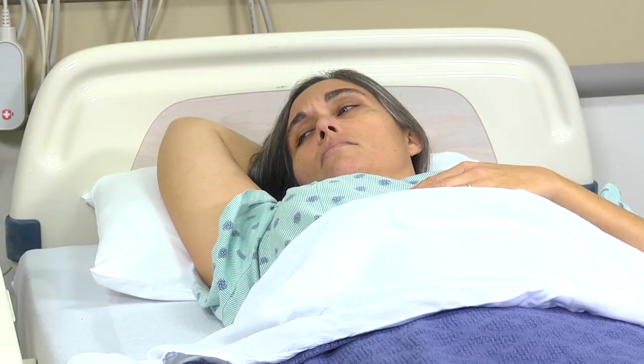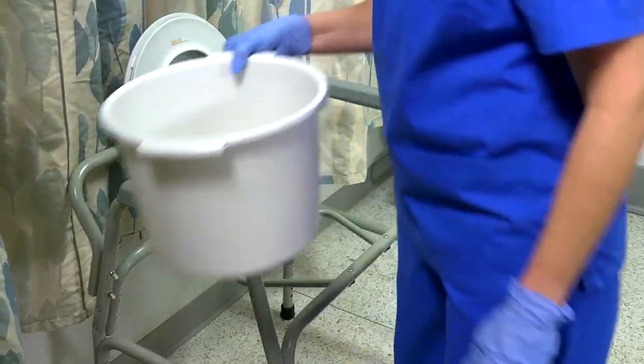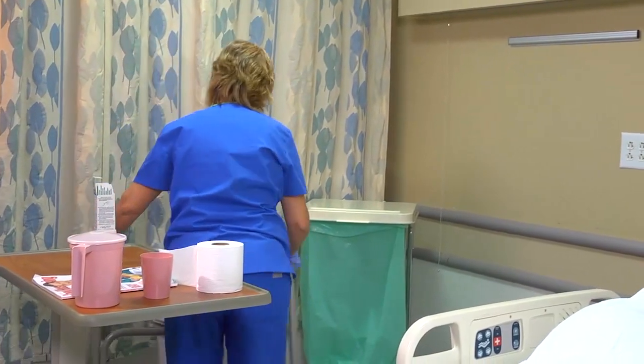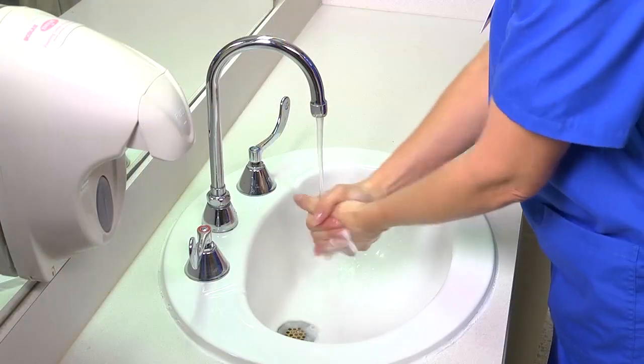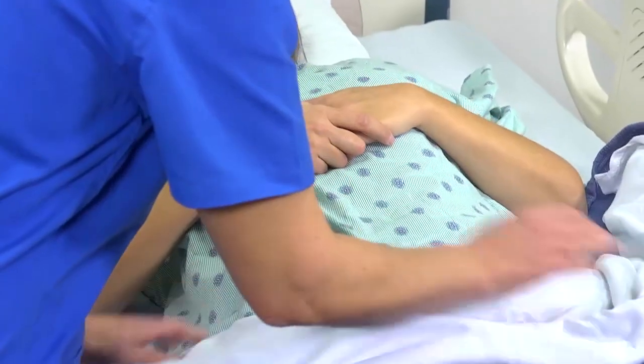Remind the patient not to flush the toilet before you've had a chance to inspect the character of her stool. If the patient needs your help washing her anal area with soap and water, remember to wear gloves. Next, remove and discard your gloves and perform hand hygiene. Assess the patient's abdomen for distension.